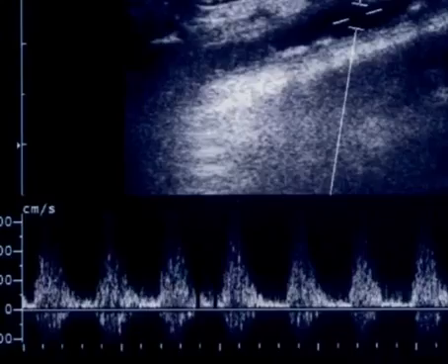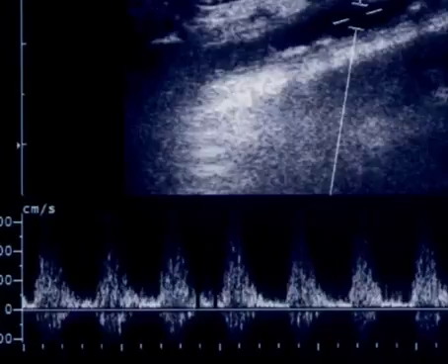And then if we continue just a little bit further beyond a stenosis, we see this kind of pattern. This post-stenotic turbulence, this is, again, the telltale sign that we truly have a flow-limiting stenosis, where now the flow is completely disturbed. It's lost so much energy trying to work hard to get through the narrowed area that now we have this turbulent pattern.